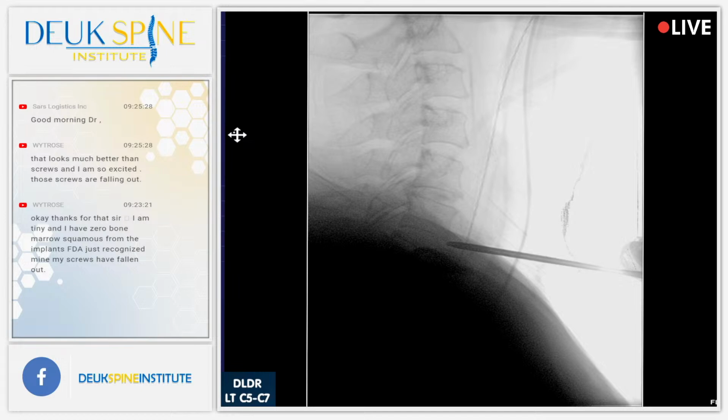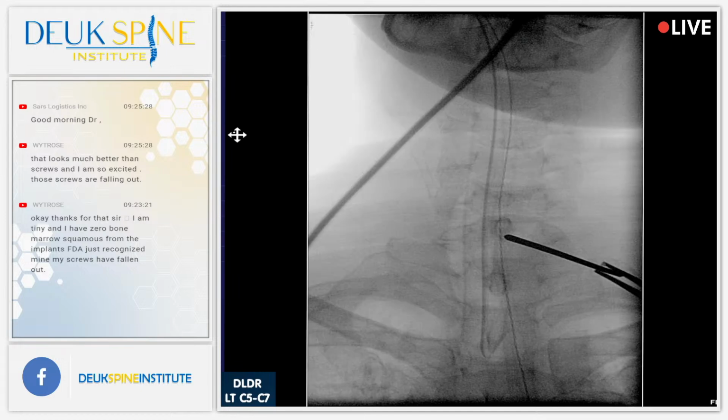The esophagus sits right on top of the spine. All right, perfect. So you see how the tip is in the middle? Show us, Jordan. The tip of the dilator is in the middle of the spine. Show us the esophageal temperature probe. You see that braided probe? That's the esophagus. Notice how it's deflected to the side, right where I'm working. Then show us the endotracheal tube, which goes into the trachea, and where it ends. Yeah, it ends right there, above the carina. All right, lateral view.